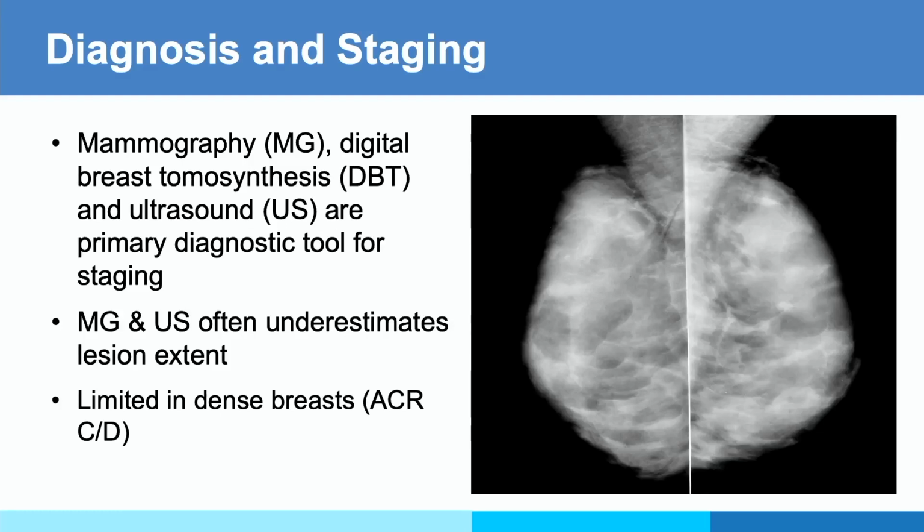And I think in this case, it can be really clear why we are particularly limited in women with dense breasts. In this breast, I don't even know if the woman has a cancer or not. This is, yes, a wild guess. In screening, I probably would say this is a normal exam, and still there can be a massive cancer in there.